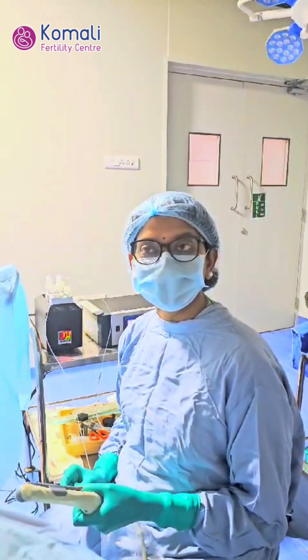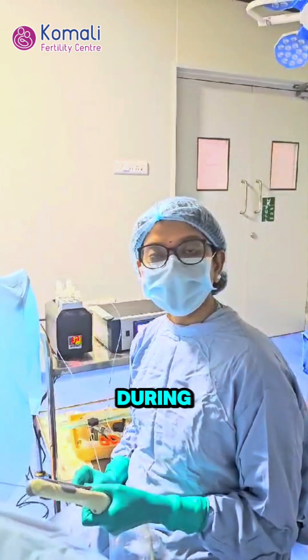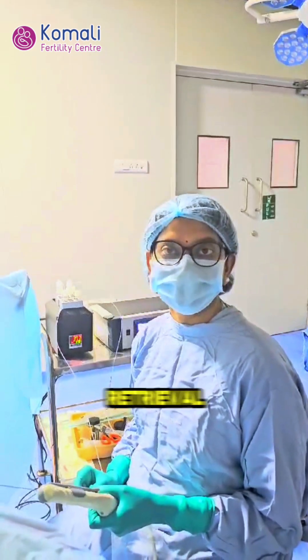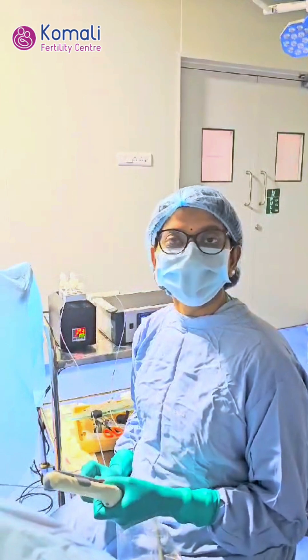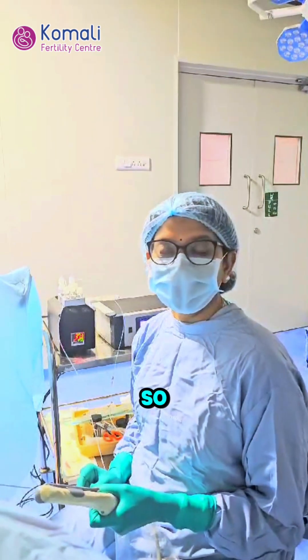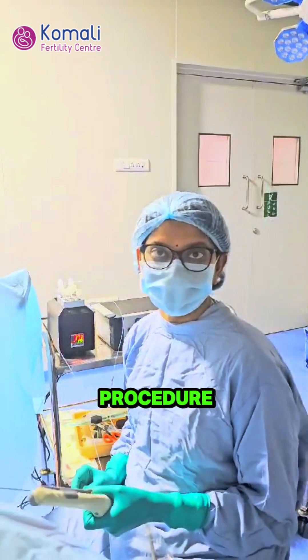Today I will be showing you a procedure called Oocyte Retrieval. During the IVF process, the first step is collecting the eggs. This will be done under ultrasound guidance. I will be explaining each and everything step by step. Let us go into the procedure.